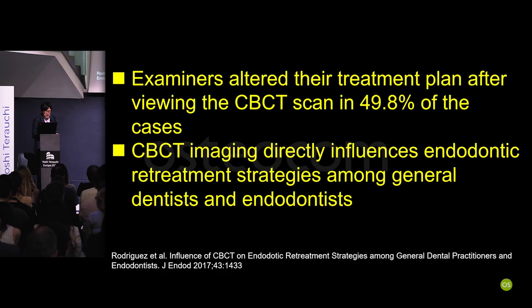And this study, it's very difficult to pronounce his name, Rodriguez. Am I right? I don't know. He actually found examiners altered their treatment plan after viewing the CBCT scan in almost 50% of the cases. So this is dangerous. If you don't take CBCT, you can be wrong in 50% of the cases. So you don't want any surprise.